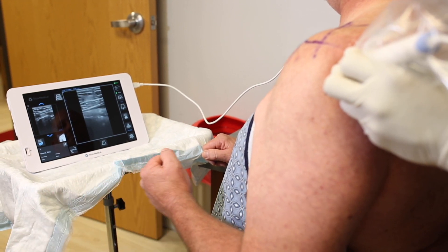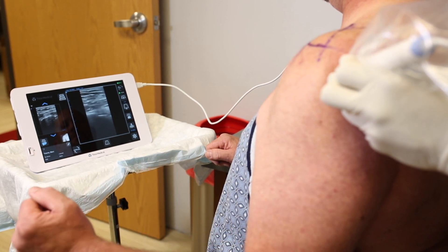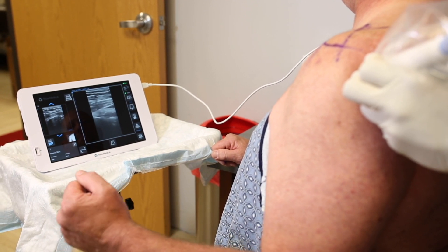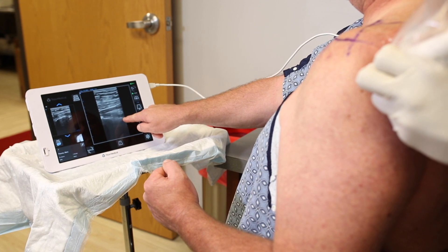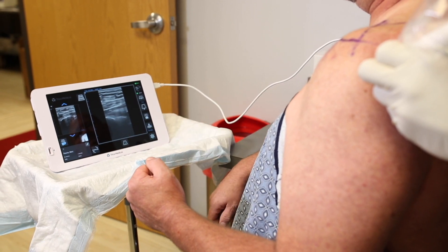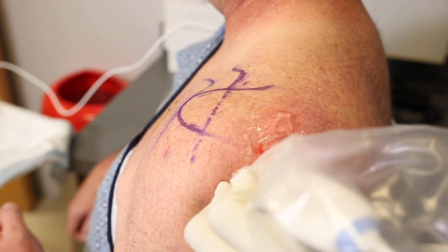Once we have the joint centered on the display, we know the exact angle to place our MyEye2 needle arthroscopy device. The portal location will vary based on every patient — typically it's between one and two centimeters distal and medial to the posterolateral edge of the acromion. The nice thing about using ultrasound is we can be sure we're directly over the joint and don't have to guess.